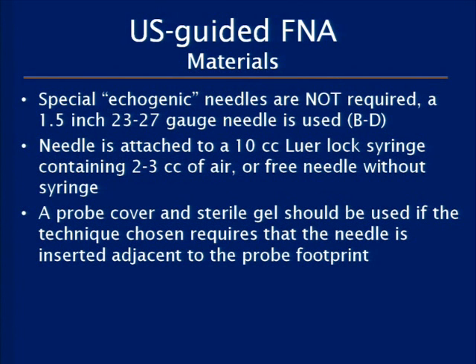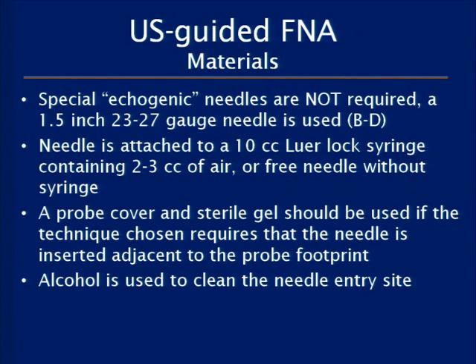The issue is if you go through gel with your needle as you're doing the biopsy, that gel is going to hamper the sample and make it very difficult for the cytologist to interpret it. The gel messes up the cells. You just need to clean the skin with some alcohol. You don't need to use a lot of betadine or anything like that. A little alcohol is perfectly fine.